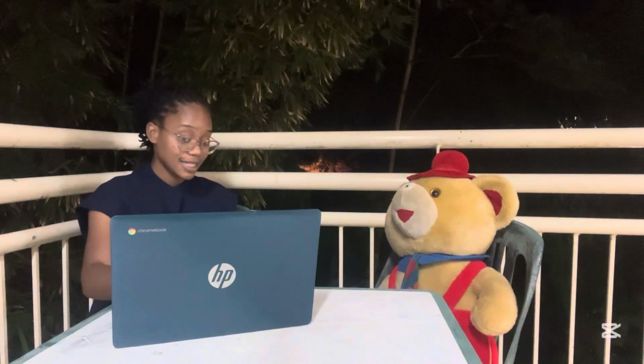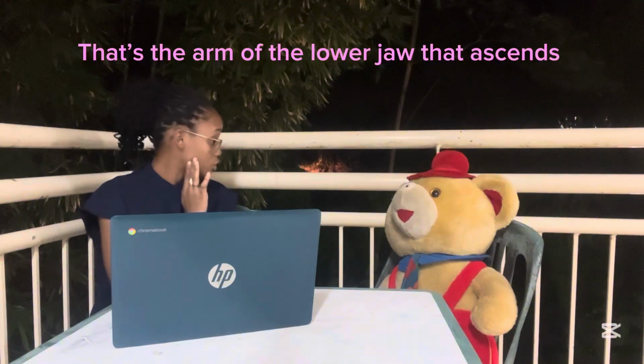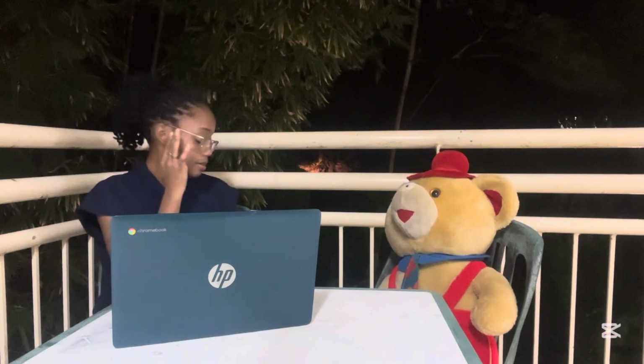It has a Pell and Gregory class of B2, B meaning that the height of the crown is between the occlusal plane and the alveolar bone crest, whilst 2 means that the crown is partially in the ramus of the mandible, and that's the arm of your lower jaw that ascends. Both the height of the crown of the tooth and the position of the crown in the ramus give moderate difficulty for the extraction.